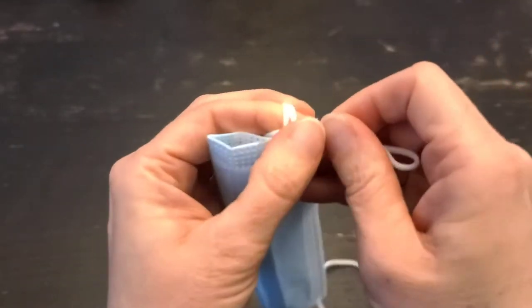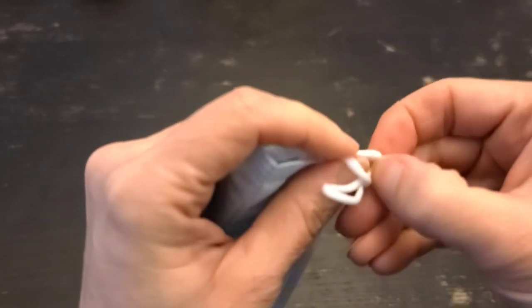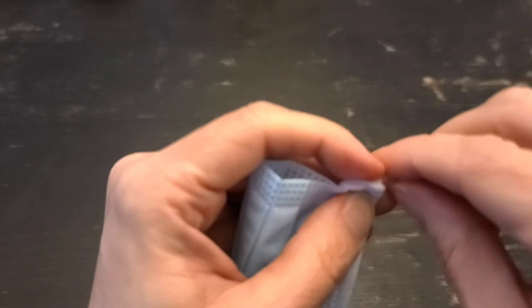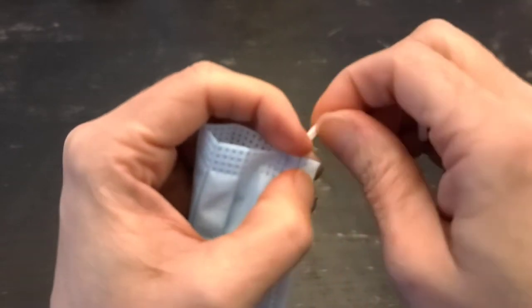We're just going to make a simple loop knot. Here's the important part: the knot has to be as close to the mask as possible. So as you're tightening it, you're going to slide it close to the mask. This is really important.